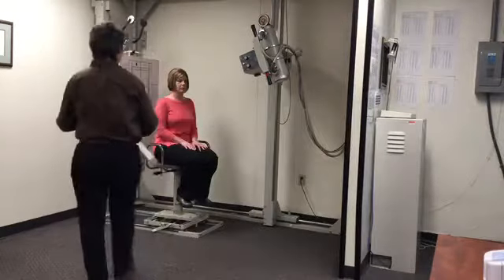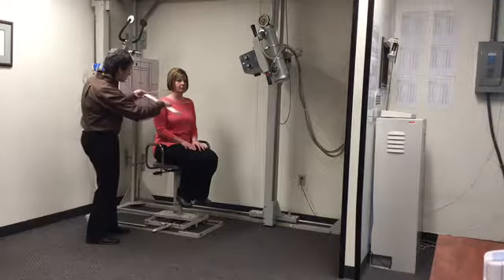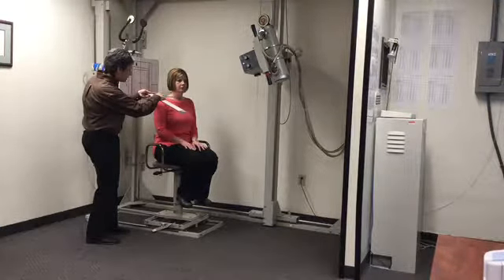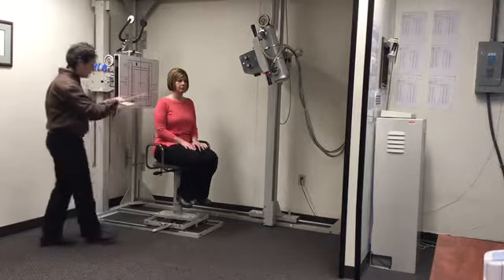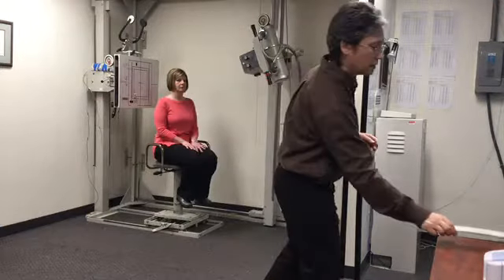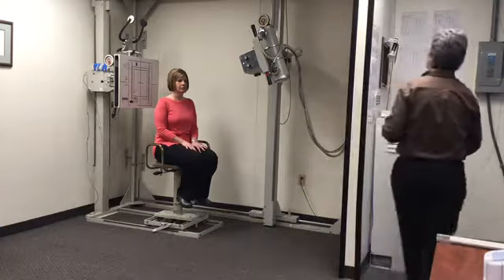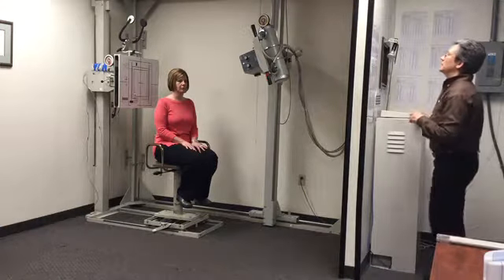and using the caliper, we're going to measure from the back of the patient's neck at mid-neck, C4, to the front, really gently, at C4. And she's between 9 and 10 centimeters, so when we're between centimeters, we set it for the higher of the two. So I'm going to set her exposure for 10 centimeters.